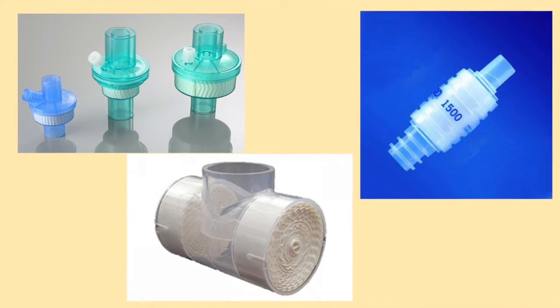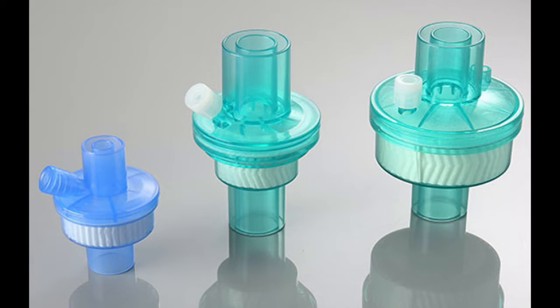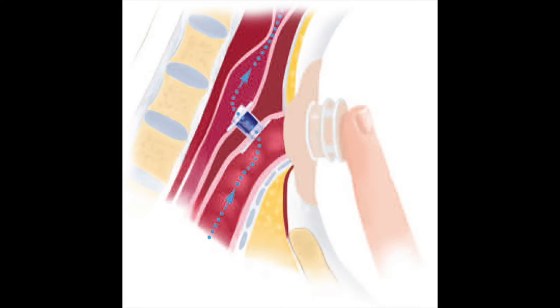Heat and moisture exchangers come in various shapes and sizes. HMEs for tracheostomy tubes are usually a little bit larger than for laryngectomy patients. Air openings are usually at the front of the HME for people who use a ventilator. In people who do not use ventilators, some HME designs use crossbars to prevent clothing from blocking the air opening. If you do not use a ventilator to breathe, you will need to place your finger over the opening on the HME to speak. Usually, a rim on the HME helps to find the correct finger location for occlusion of the air opening.